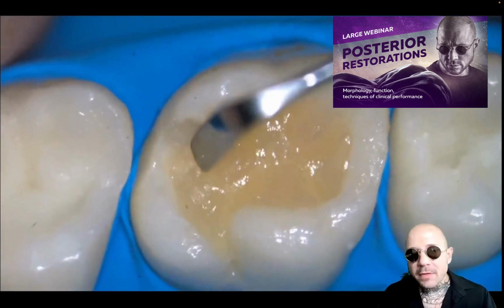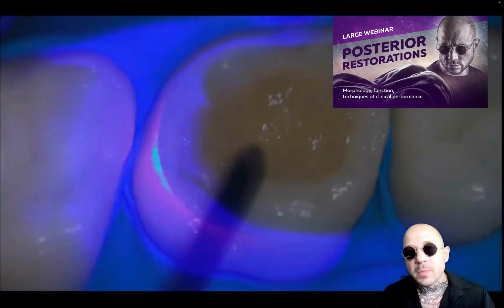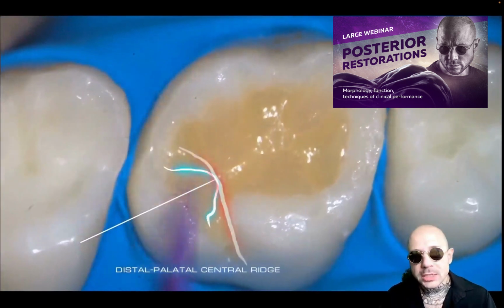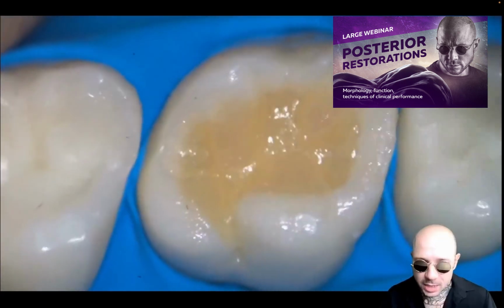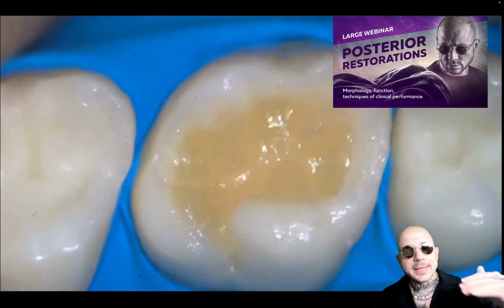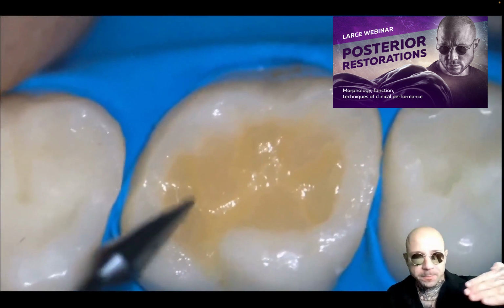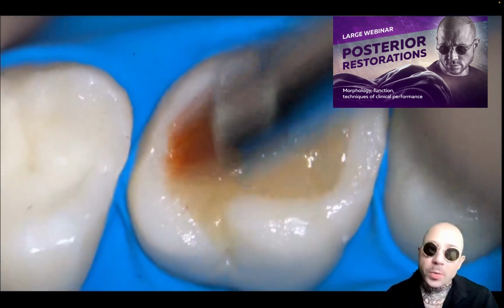Of course, this method is based on our skill and manual control, and it's not always possible to do, because not in all cases, especially in cases of really big defects, do we have enamel leftovers showing the occlusal surface with its angle that we can catch with the instrument.